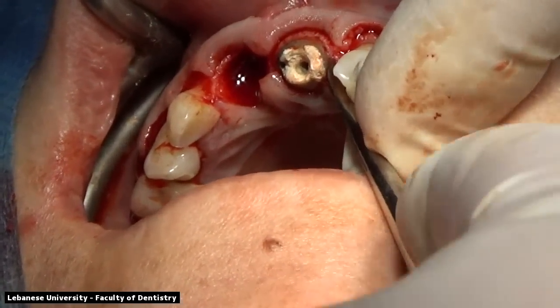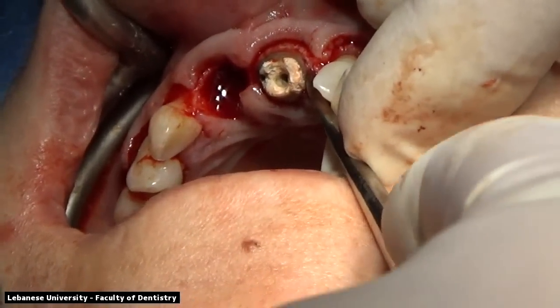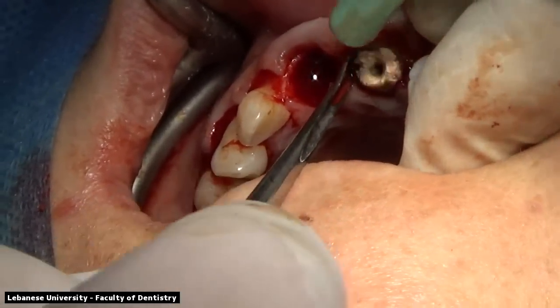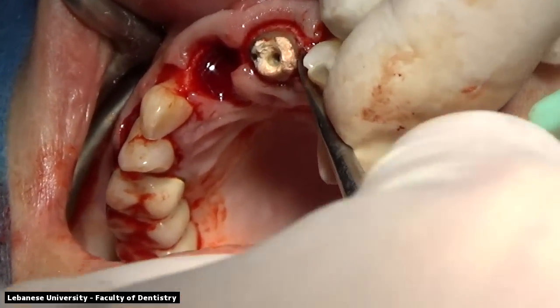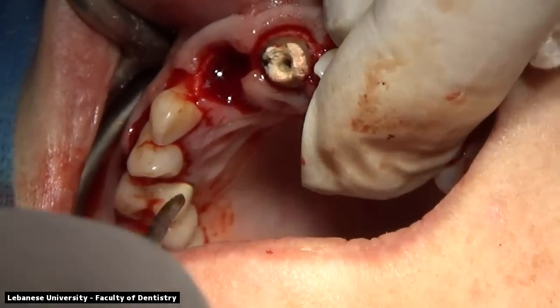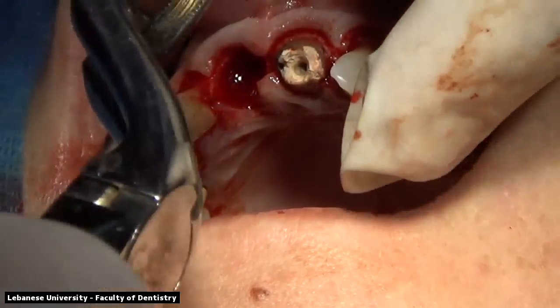Proceeding with the straight elevator on the left central incisor. Using the remaining root tip forceps with a circular motion to remove the remaining root.